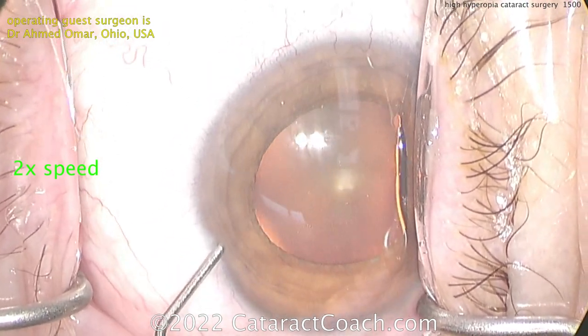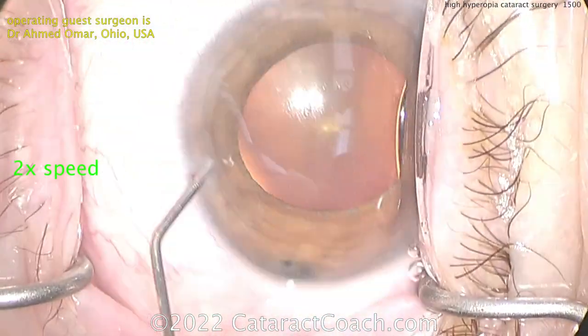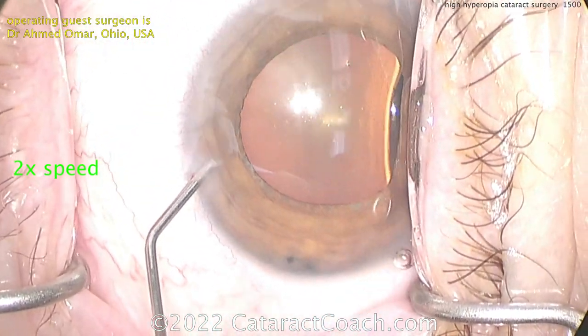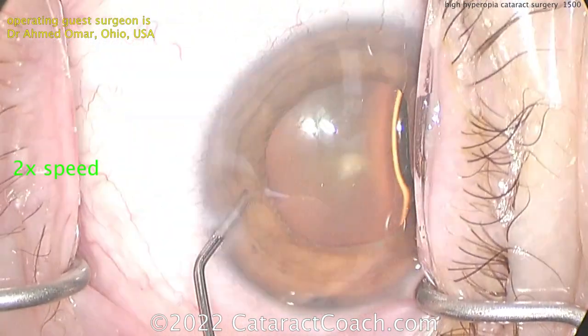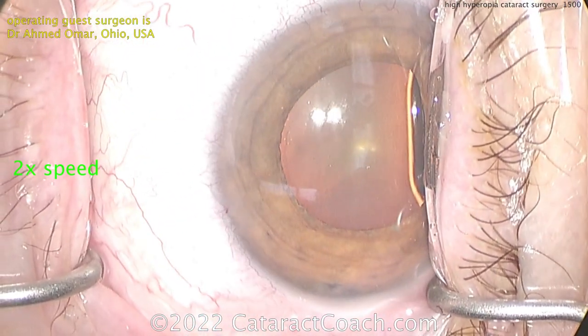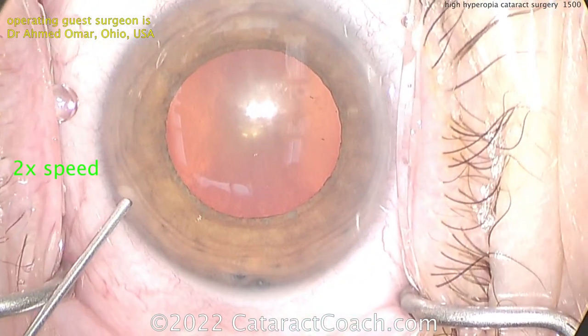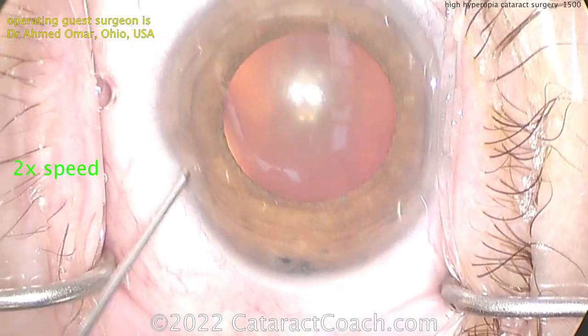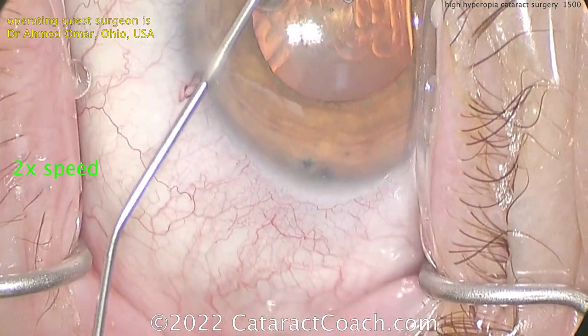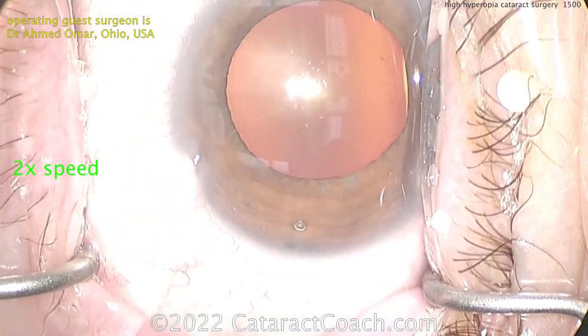Starting off here, you can see this is a small eye and not the best dilation. The key here is not to make a baby rhexis. We still want to make that five, or maybe five and a half millimeter diameter capsulorhexis. Don't make some three or four millimeter rhexis and suffer the whole case. This is a monocular patient who was sent to Dr. Omar, who is at Case Western Reserve University in Ohio, here in the USA.